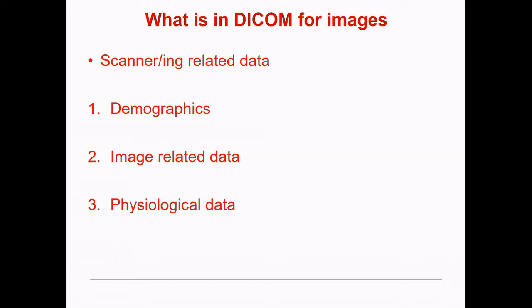You know, in radiology, we turn right and left around, and you have to know what is top and bottom. So there are different coordinate systems saved in the DICOM header. There's the scanner coordinate system and the real world's coordinate system. So those are all image-related data. But actually, we save quite some demographic data in the DICOM header, like the patient's name, their age, because they are relevant for instance for dose calculations before we do a scan, or for the amount of energy that we can deposit when we do an MRI scan. So we need weight, we need age, and this is put in before the patient gets scanned by the technician and gets all written into these DICOM forms.